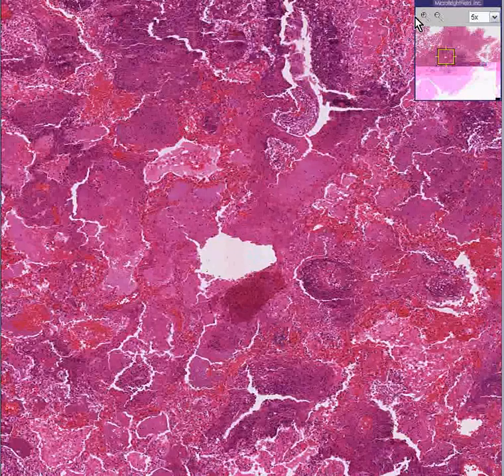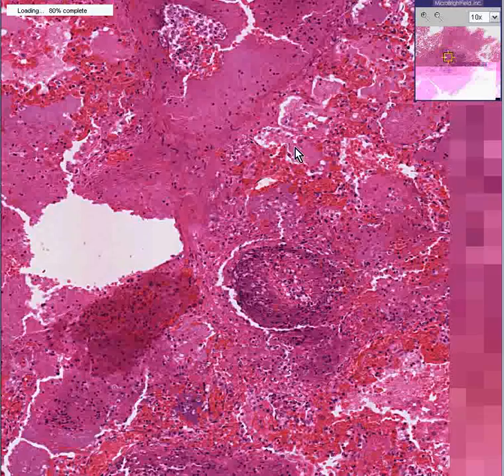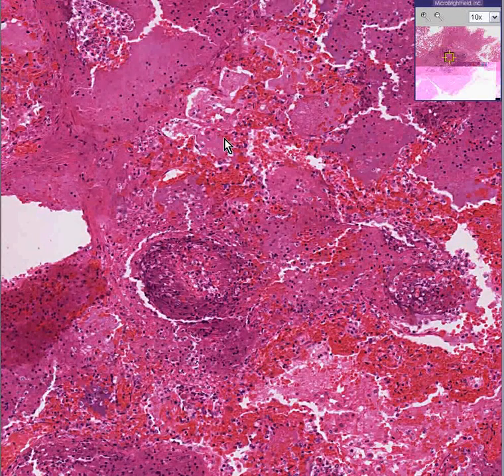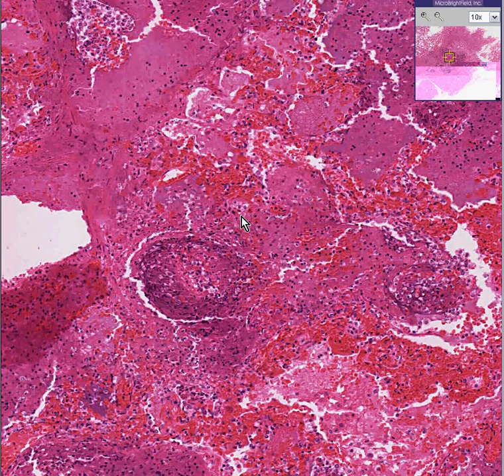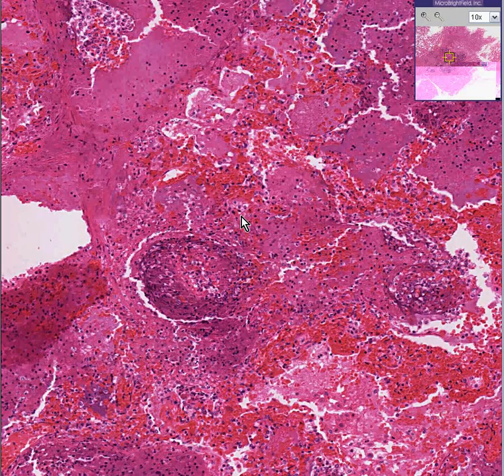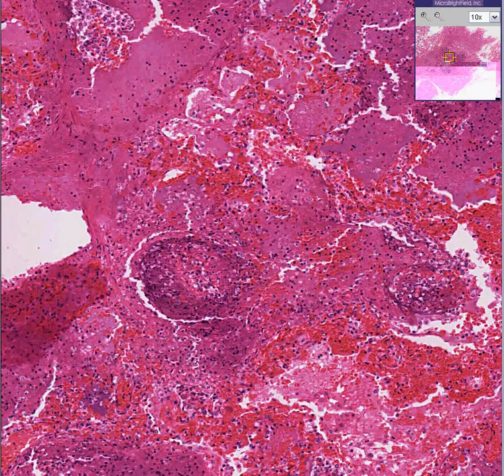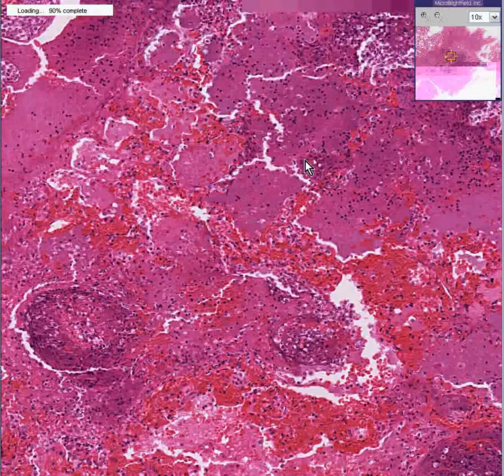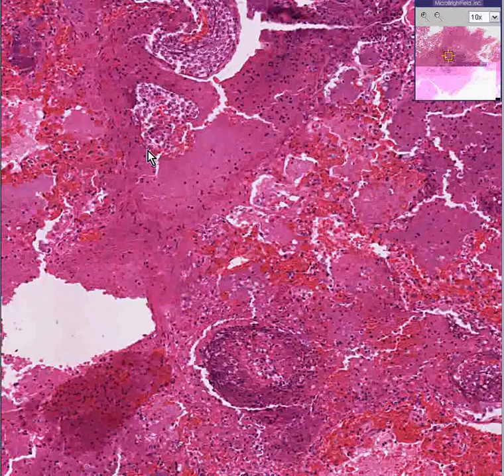I don't know the exact history on this patient, but if you look at some of these areas that have intra-alveolar or perhaps proteinaceous infiltrates, if you could recognize or make out squames, which is a type of cell exfoliated from the amnion, then you could pretty much give the cause of this aspiration as being amniotic fluid. Otherwise, everything inside here is junk — it's inflammatory cells, it's neutrophils, it's fibrin, it's necrotic tissue.